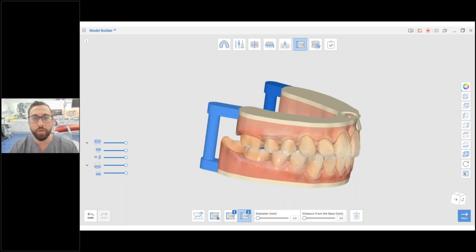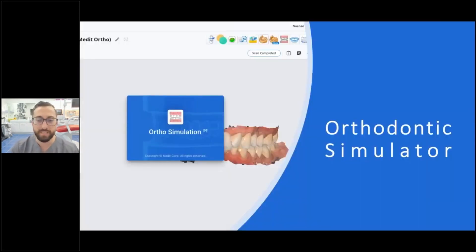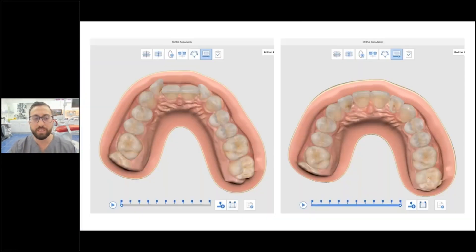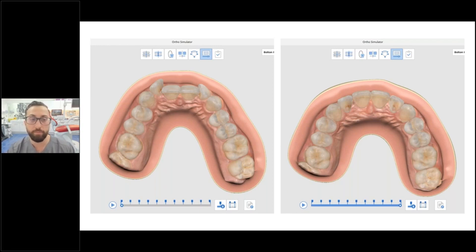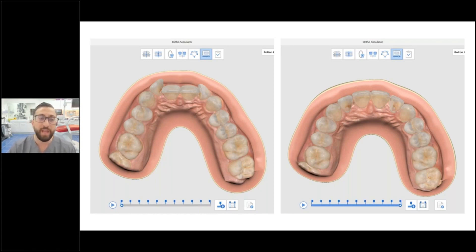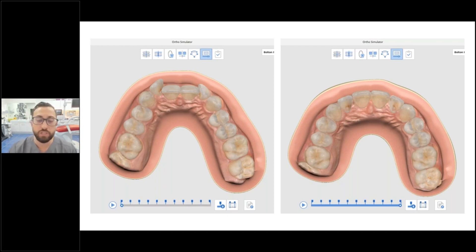The model builder can be used for anything you like: thermoform appliances, suck-downs, retainers, orthodontic analysis, everything. Then you have the orthodontic simulator. One common misconception is that these are not orthodontic treatment planning tools — they are simply a communication tool. You scan the patient and with a few clicks show them what could be possible with orthodontic treatment. And importantly, these Medit apps are free for anyone, even if you have a Three Shape scanner.